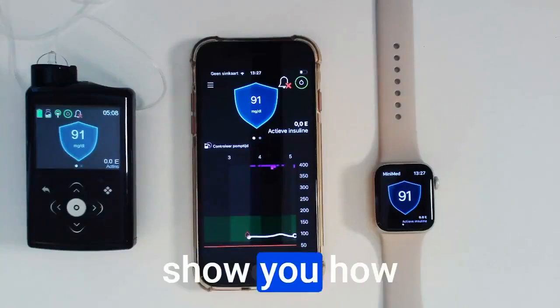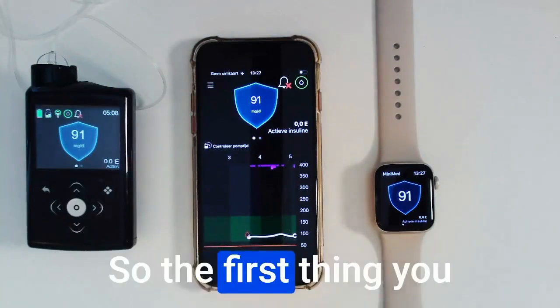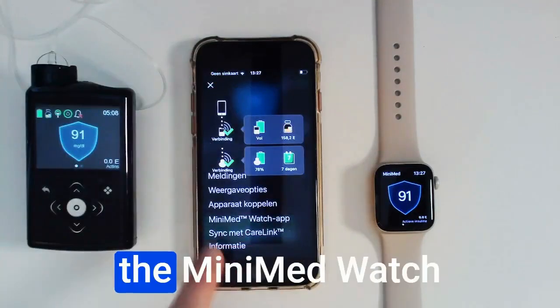Welcome. In this video I will show you how you can put your MiniMed Mobile app on your Apple Watch. The first thing you have to do is check if your MiniMed Mobile app has the MiniMed Watch app mentioned in the settings.